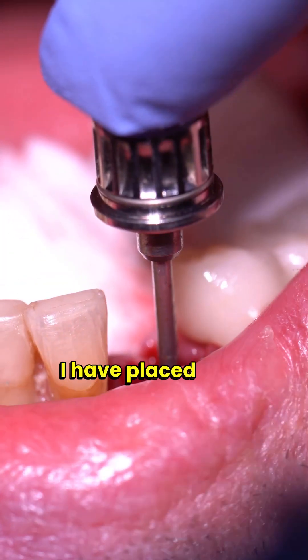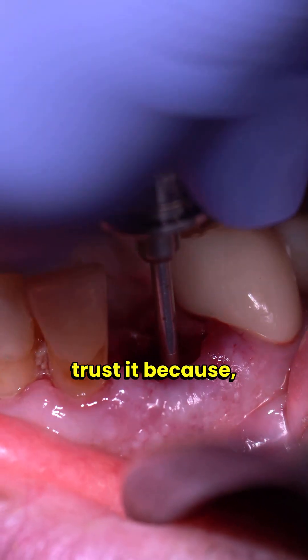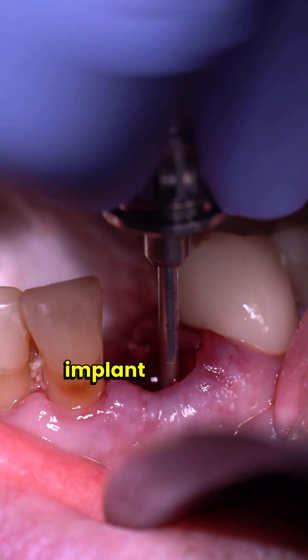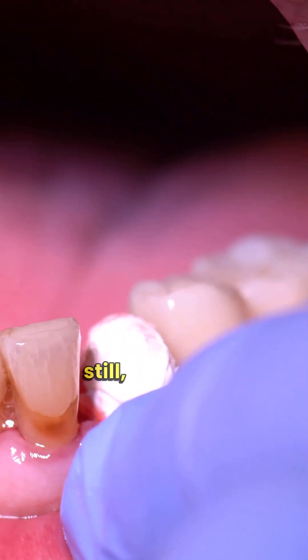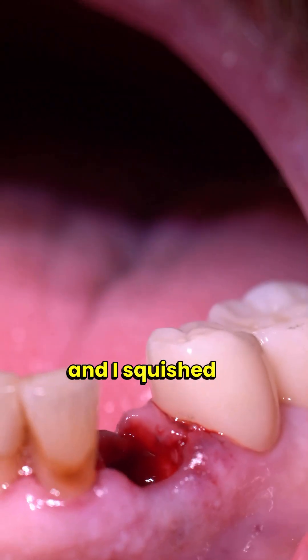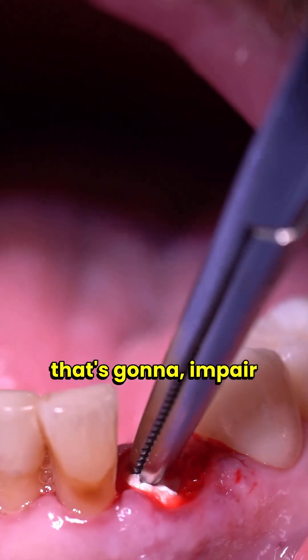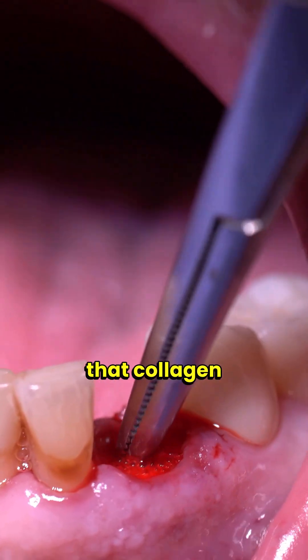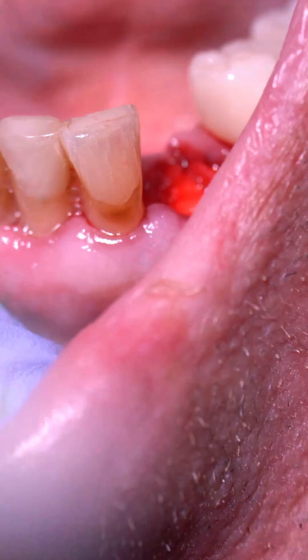I could have put a healing abutment on in this case, but this patient is a smoker. I've placed four other implants on him and they've been very successful, but I still don't fully trust it because he's a smoker — I want this implant to be buried. So I put a cover screw on: the cover screw is small and flat, while healing abutments are large. Because I still don't trust it, I'm also putting in a collagen plug — I cut it in half, squished it, and use it as a kind of band-aid in case anything tries to impair healing or integration of the implant.